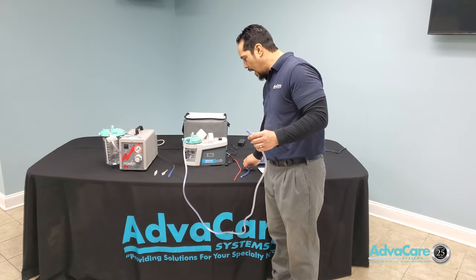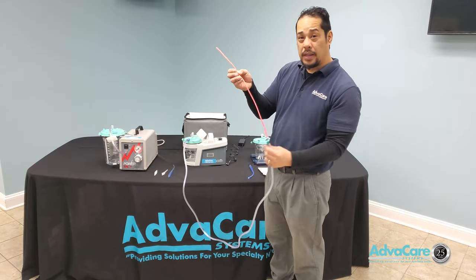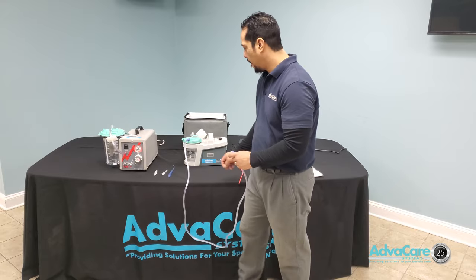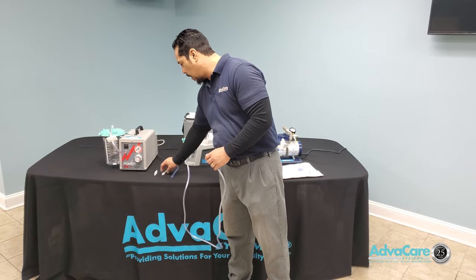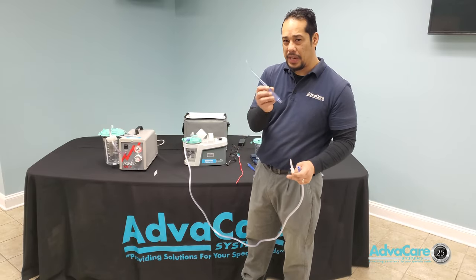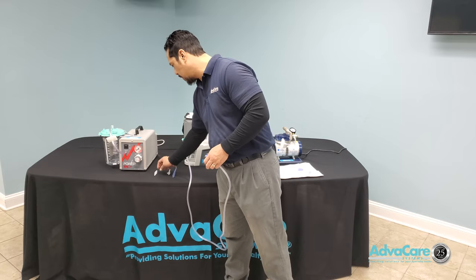Just as on the stationary suction machine, use the same length of tubing to connect to the front of the suction canister and then apply either the Yankauer or catheter for adults, or the little sucker or pediatric Yankauer for infants or pediatric patients.